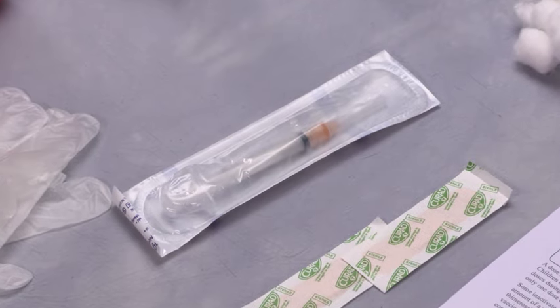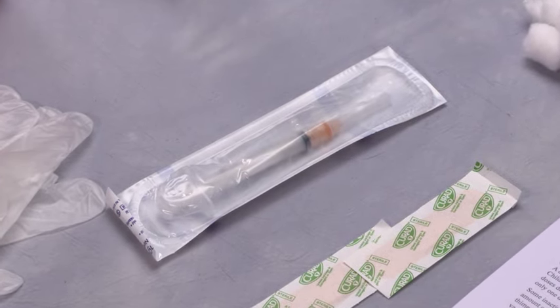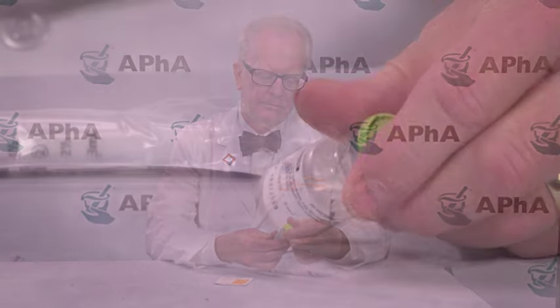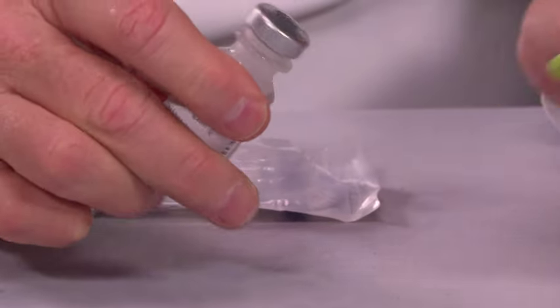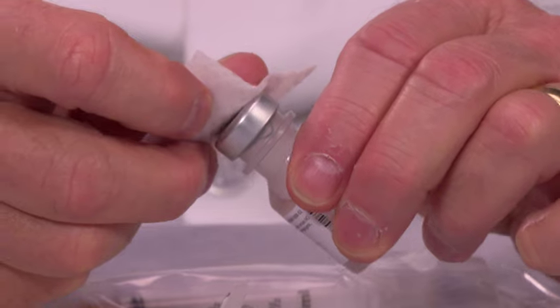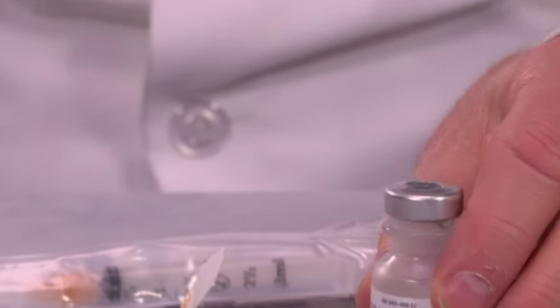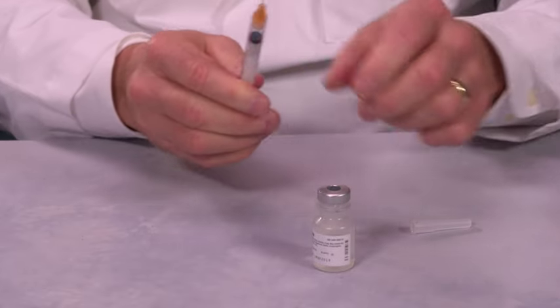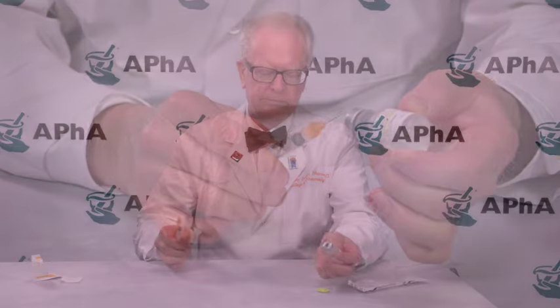To prepare your syringe for injection, review what is in each vial. For example, one vial may contain the antigen and one may contain a dilutant or adjuvant. Remove the plastic cap from the vial. Swab the top of the vial with alcohol with one swift motion. Fill the syringe with air equivalent to the volume of vaccine you need to withdraw. Pull back the plunger to the certain mark.